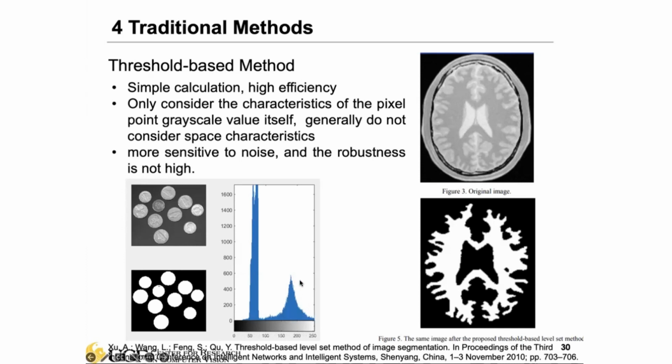So you have another group of pixels. In this case it will be easy: we can purely base on the pixel intensity and just set up a threshold. Maybe a decent threshold to separate these 2 groups of pixels is around 120. So you can just put a separation here.